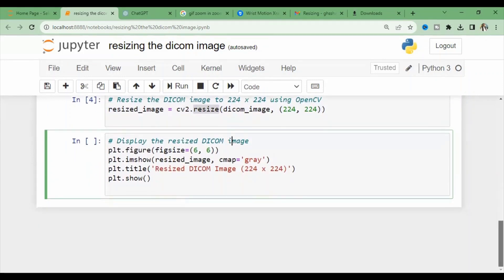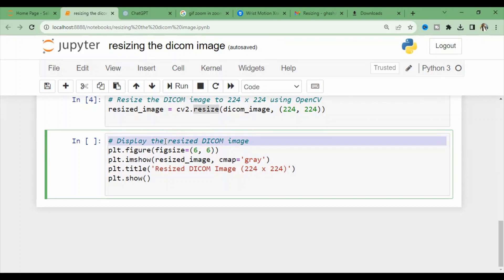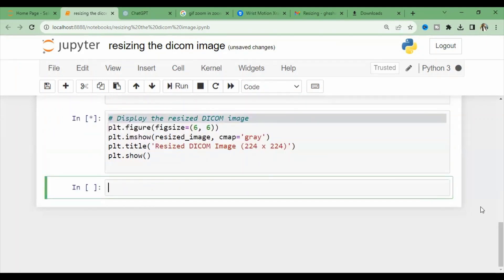Now we want to see the resized DICOM image. This code is similar to above. We compile this code and here you can see that the original image differs from the resized DICOM image.